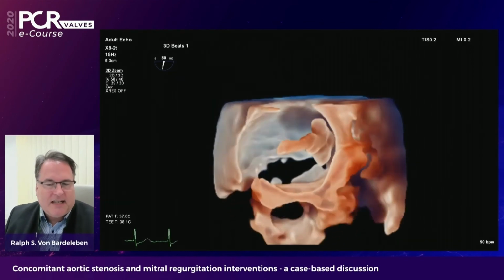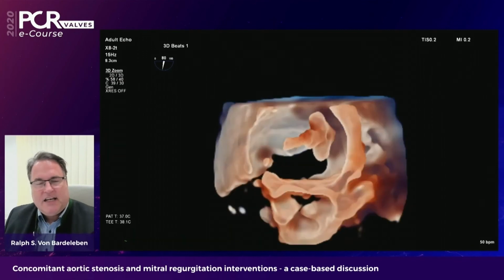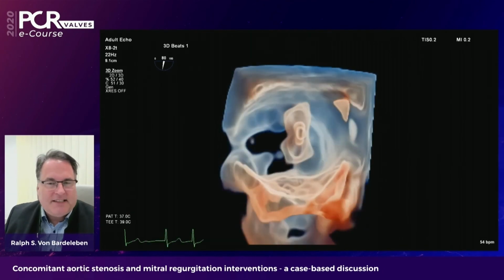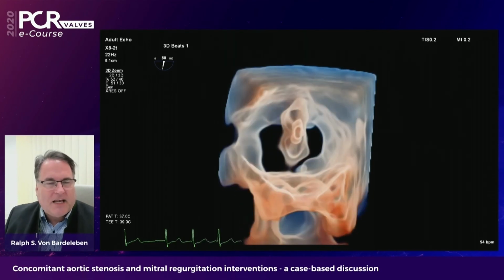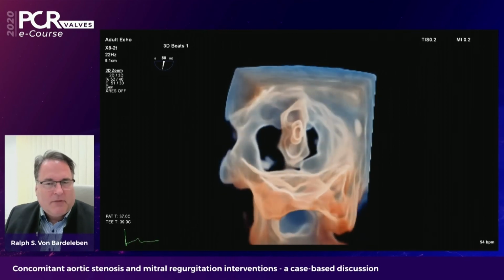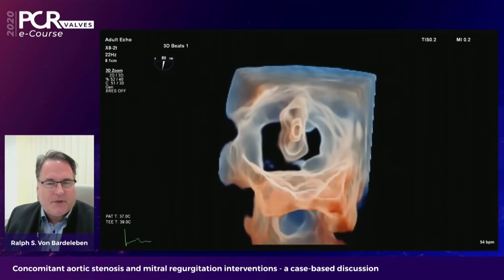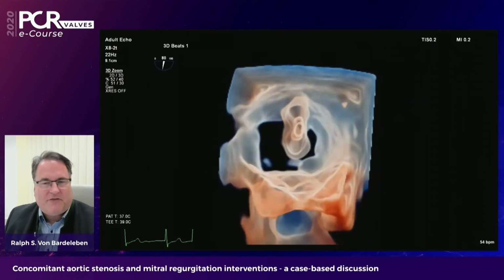And what is also nice is that if we go back one image, we can look through the devices and we can look through texture. Look at the aortic valve. The leaflets are continuous and you see them behind the aortic root. You can see the mitral leaflet behind a metal object. This is nitinol, but we can still look behind, and this will give us a whole new perspective on the valves, on the treatment, on the rotation, on the efficacy. And this is just the first step.